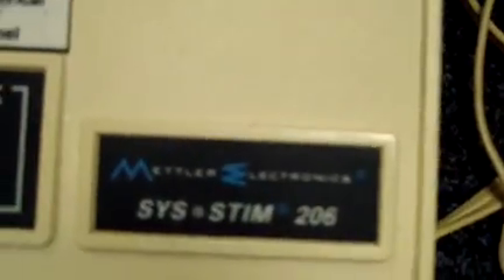Keith from DCSP Medical. Today we're looking at a Mettler 206 muscle stimulator.